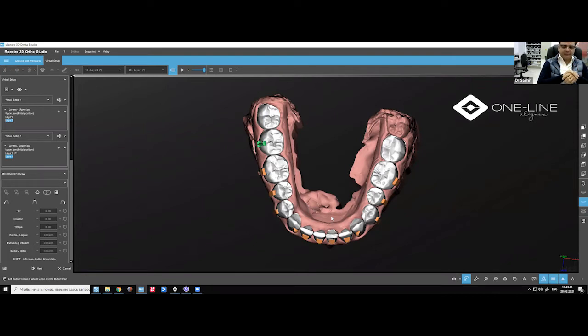So there is OrthoCaps from Germany. I think you know the doctor from OrthoCaps. Yes. She is using two or three kinds of thicknesses for the movements. She's using daytime which are a little thinner, and nighttime which are thicker. And CA also, the clear aligner from Spain, is also using three kinds of sheets: the soft, medium, and hard.